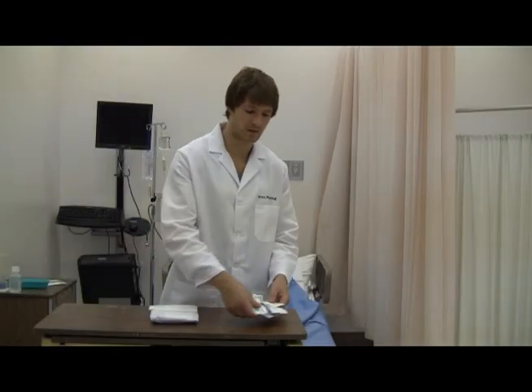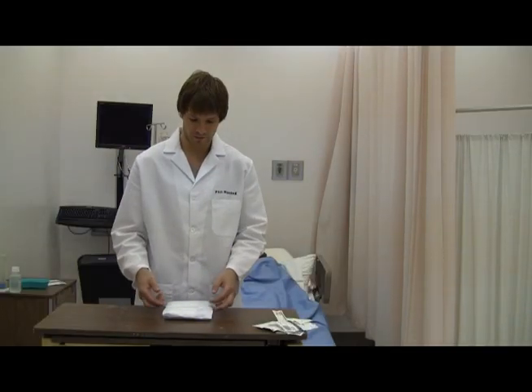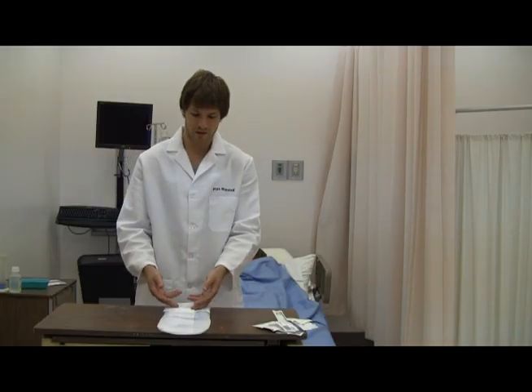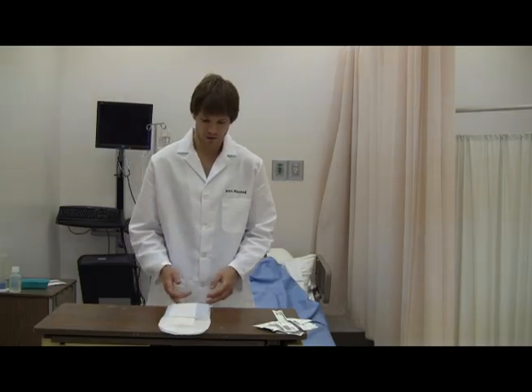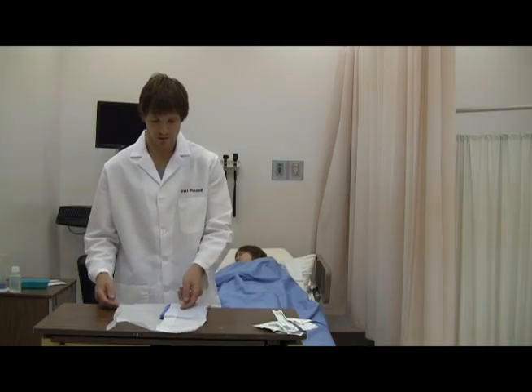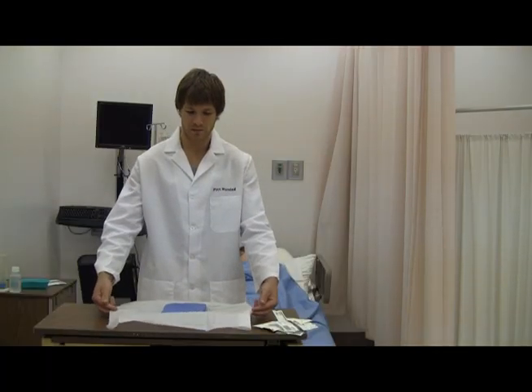Okay, so what we're going to do is put all our sterile dressings off to the side and focus on the towel. What you want to do is spin it so that you're going to open away from yourself. Take two fingers, put them underneath the cuff and pull away. Two fingers underneath the cuff and pull towards you. Two fingers underneath the cuff and fold it to the right. And another two fingers, pull towards you to the left, and crease it to keep the paper down so it doesn't fold back in on top of itself.